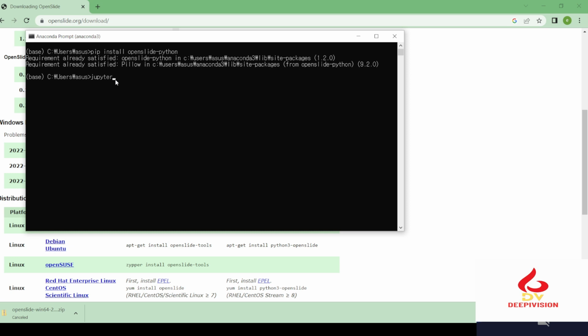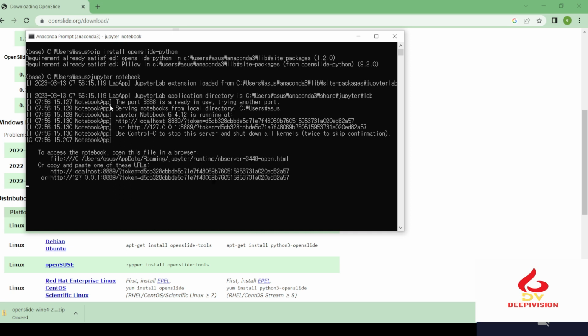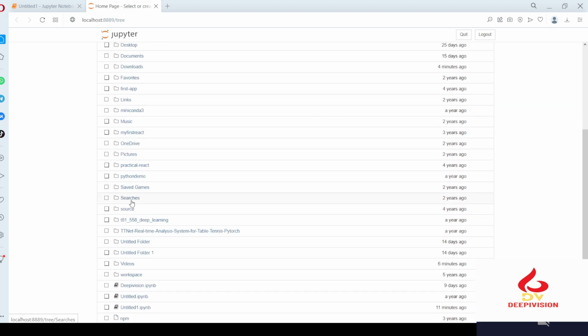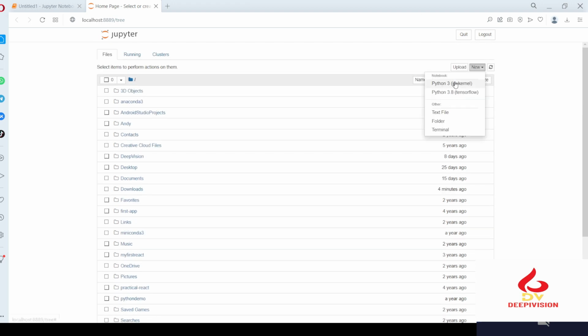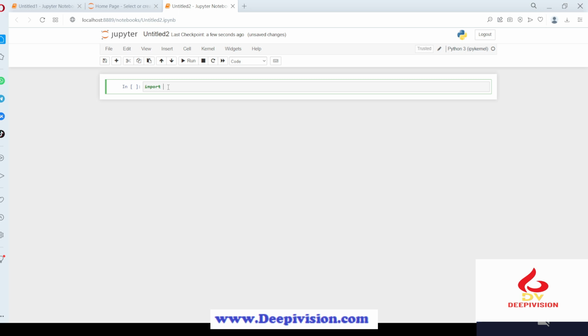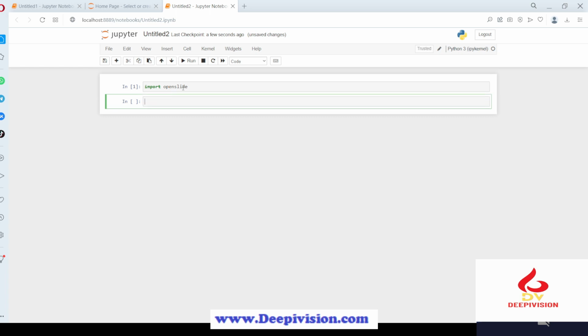Here, get a notebook. Okay, it is coming like this. So I want to just open any file, or you can make a new one from here. Okay, here we can write import. Yeah, it is working. So you can do any slides, you can use OpenSlide, you can load or any operation you can perform by using OpenSlide.